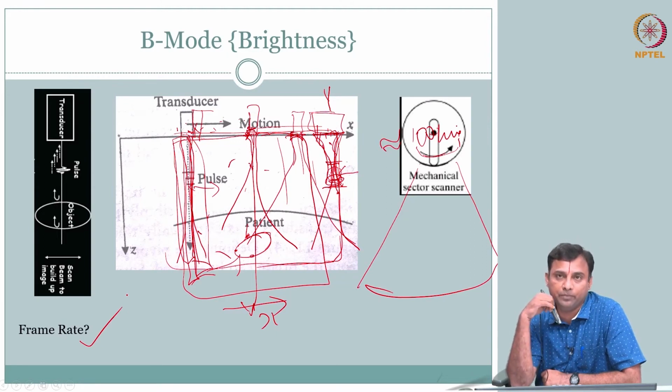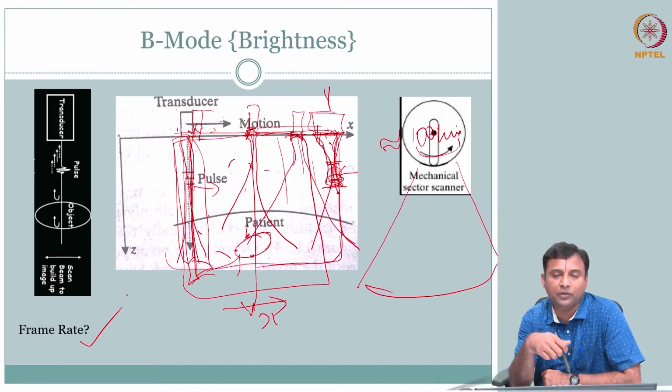You wanted to see real time, you want to see the baby sucking, right? So that means you have to do it faster and with better quality. So the whole benchmarking of ultrasound images changed.